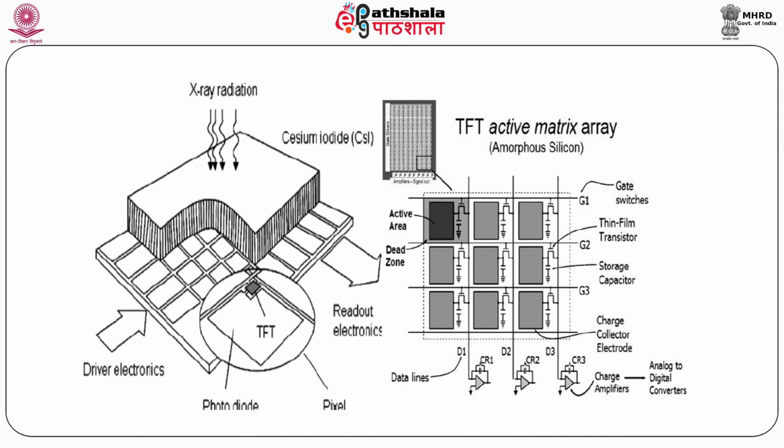This type of indirect digital detector is, as I told you, very popular nowadays, and most radiology departments use indirect digital detectors.